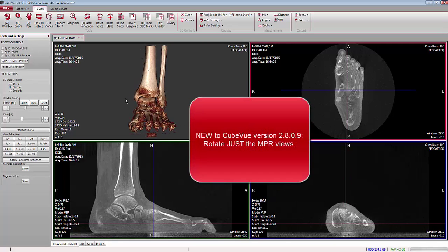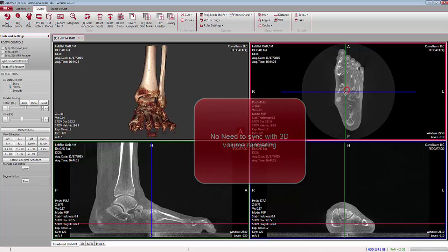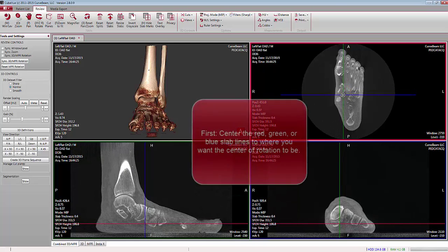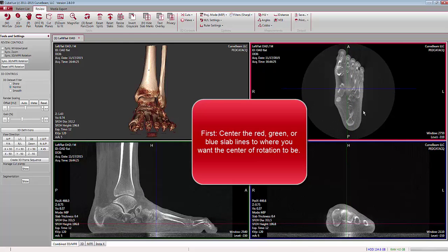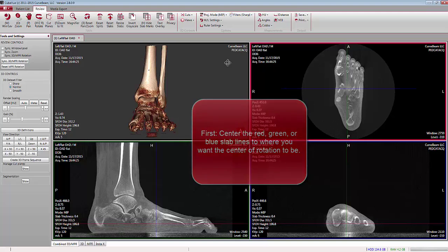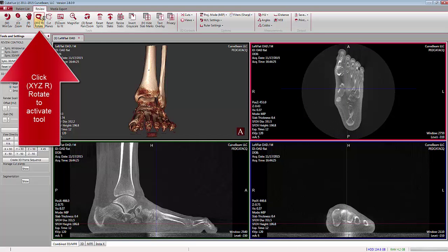A new tool has been added to CubeVue version 2.8.0.9: the ability to rotate your MPR views without having to synchronize with the 3D volume. First, grab your cursor lines — red, green, or blue — and bring them to the point in the anatomy where you would like to rotate about to make your adjustments, then go to XYZ Rotate up in the toolbar.